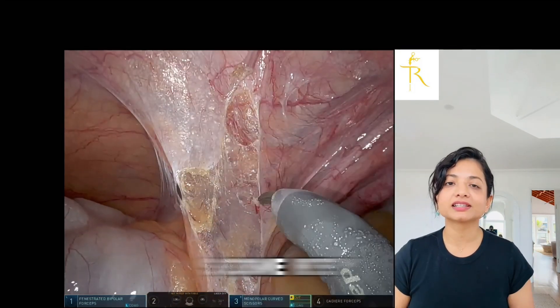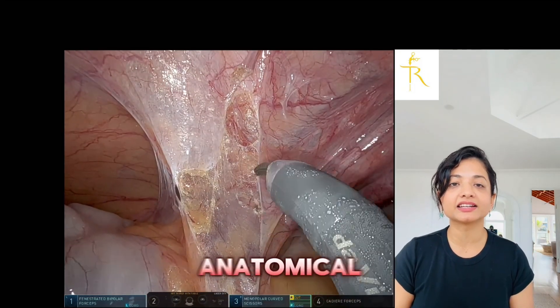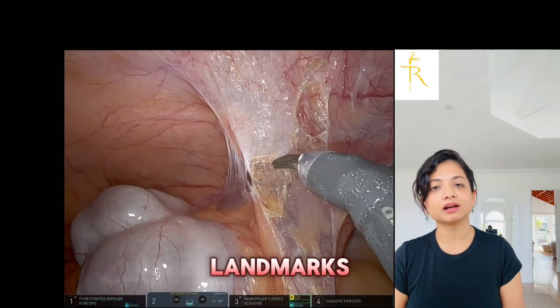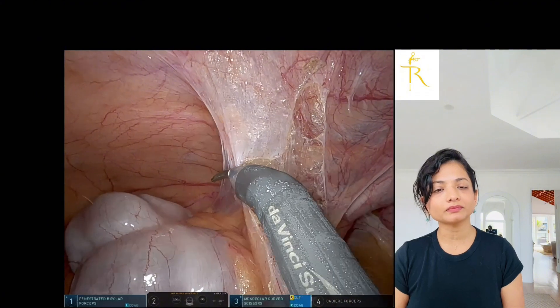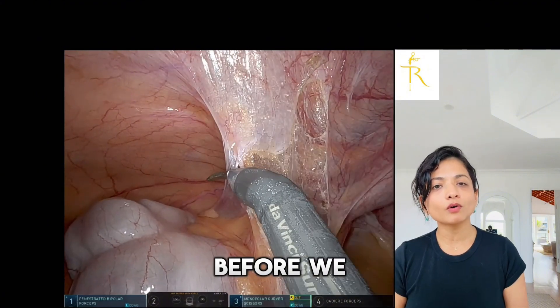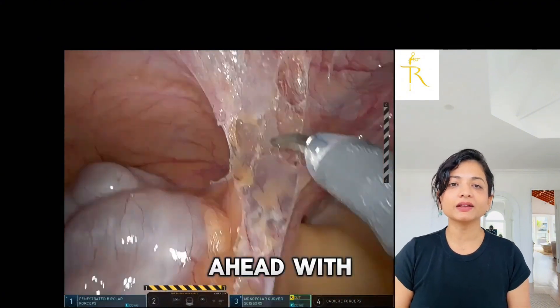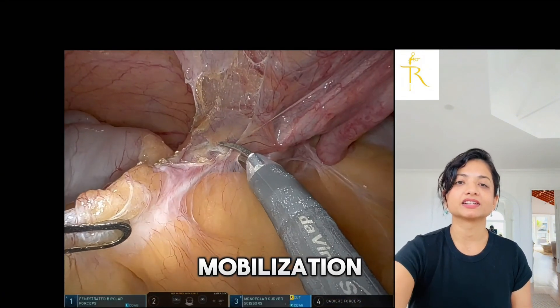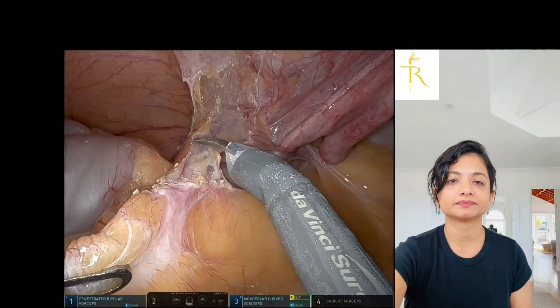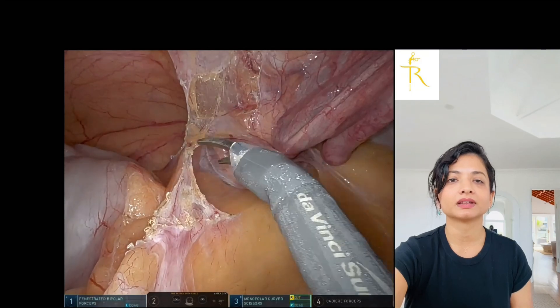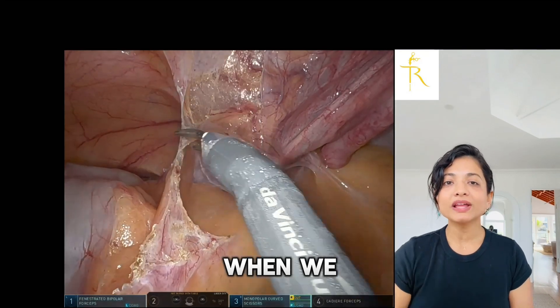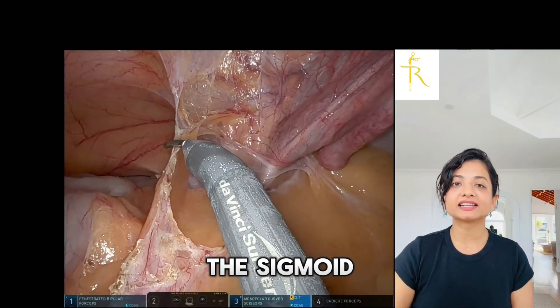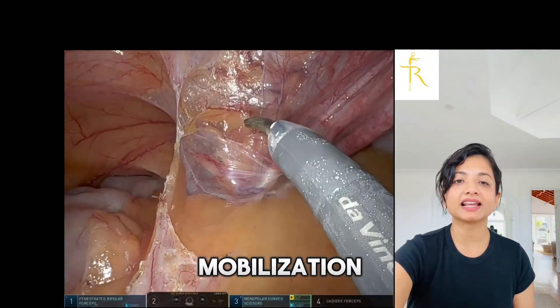Let us start by reviewing some key anatomical landmarks before we proceed with the mobilization. When we initiate the sigmoid mobilization, we identify the relevant structures in the operative field.